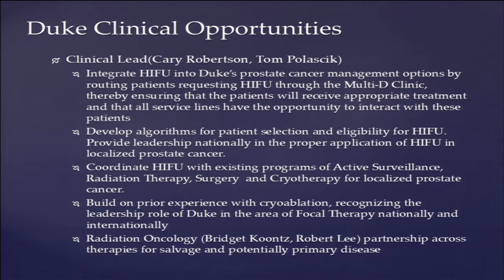So we're now beginning to see the intersection of lines of investigation where active surveillance has led to a more conservative approach to prostate cancer, where MRI-guided biopsies have now led to imaging targeted areas for prostate treatment. We now begin to see the work from the University College of London with Mark Emberton and his group, and Dr. Ahmed, describing over 2,000 patients treated with focused ultrasound and a large percent with focal MR-guided fusion techniques.